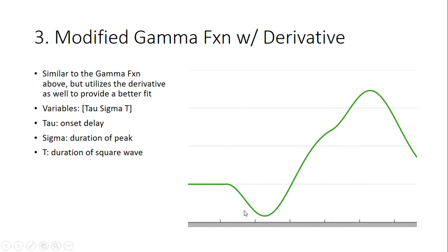Again, these are just generalized shapes. It may appear different; the data is going to determine it. I just wanted to include this to give you an idea of what the output would be. And if you change these values as well, the shape itself would change.